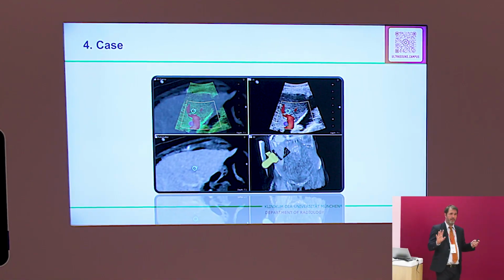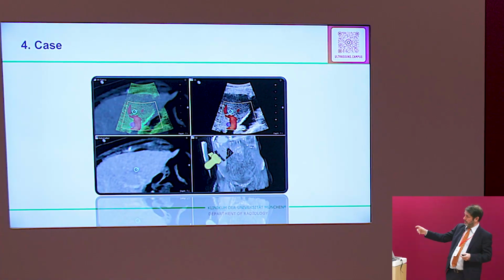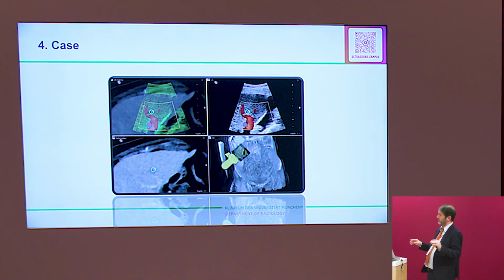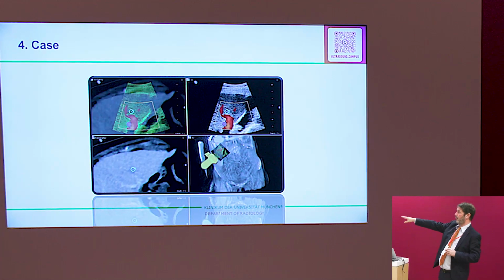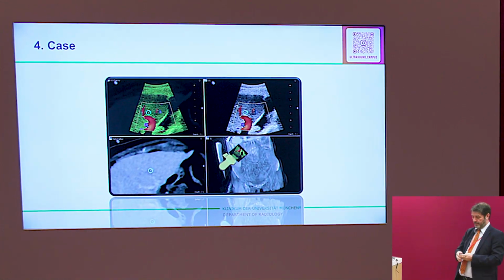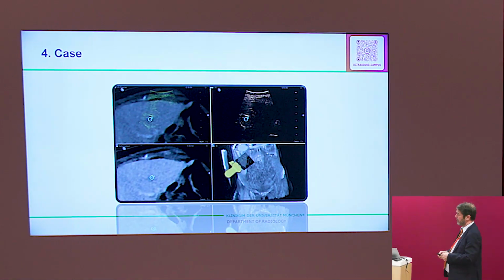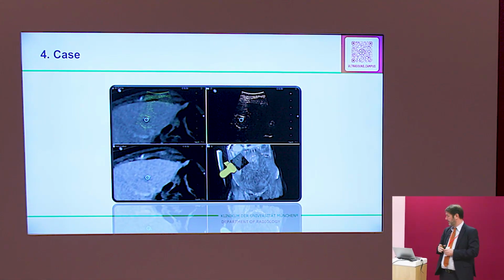I just use different layouts, so you see, I check if I turn the knob, is the plane fine or not. We see the border of the CT liver looks very similar to the border of the ultrasound liver. So our registration is fine. In the next step, we have to think about what kind of lesion it might be. So we see our blue circle there.